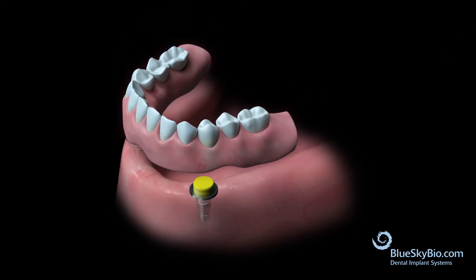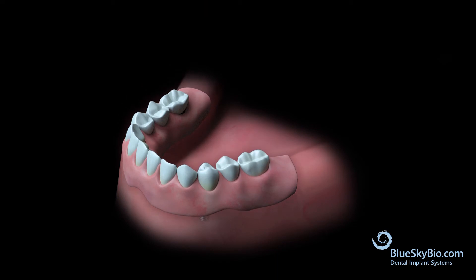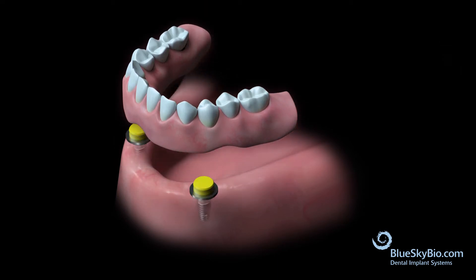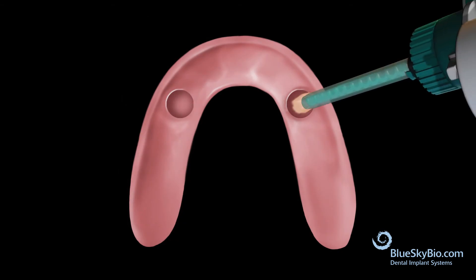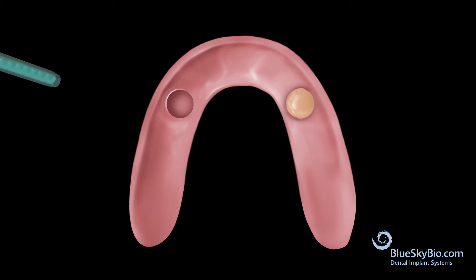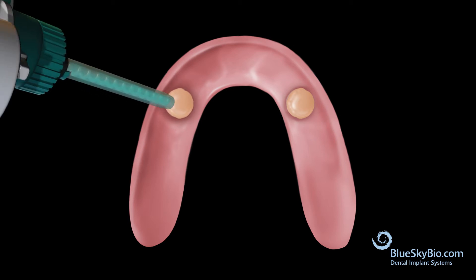Verify that the denture is seating passively over the yellow super snap insert. Adjust the denture as necessary for a passive fit. Clean and dry the denture thoroughly in preparation for housing pickup.